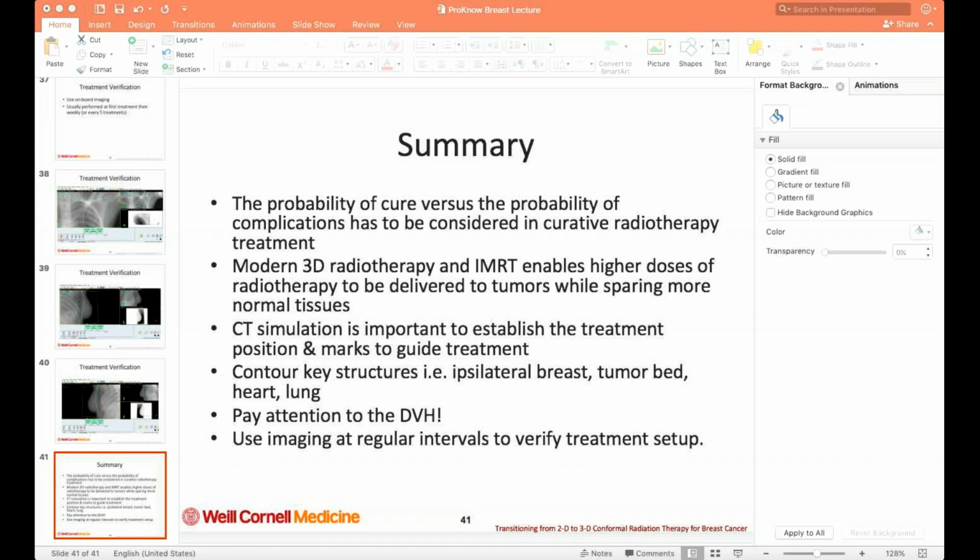So one more question. Is there really any difference between contouring on a 2D CT plan and a 3D? We discussed the 3D, but on a 2D, is there any different protocol for contouring or method?